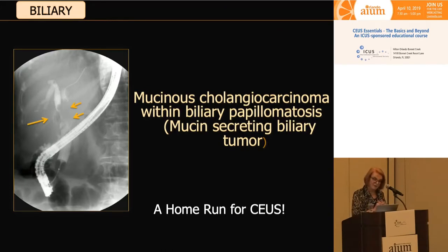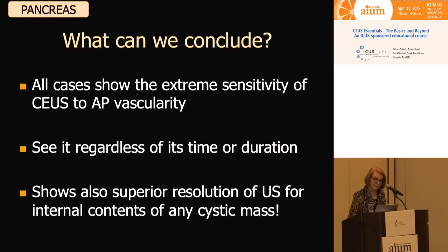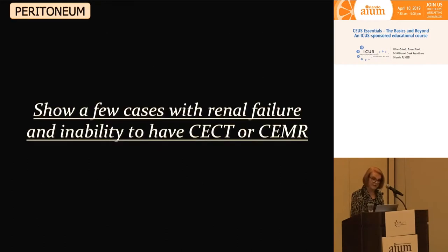We think this patient has papillary growths — this is malignant papillary intraductal cholangiocarcinoma. These scans really demonstrate how much more sensitive ultrasound is to picking up these papillary growths in the duct. As my surgeon said, 'That's a home run for CEUS if I've ever seen one.' These cases show the extreme sensitivity of CEUS to arterial phase vascularity regardless of time or duration, and the superior resolution of ultrasound for the internal contents of any cystic mass.